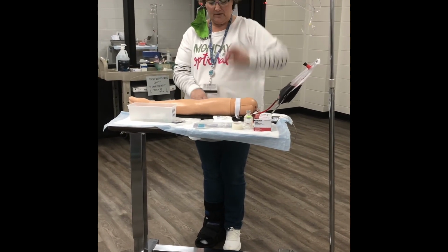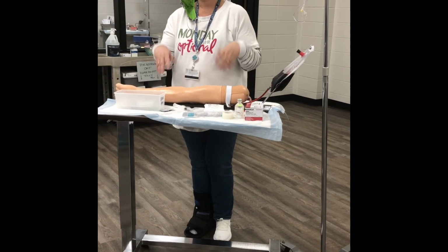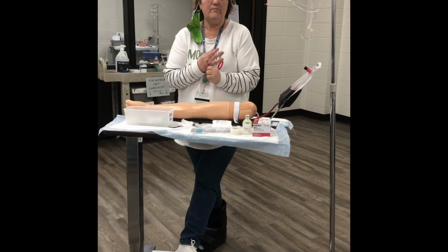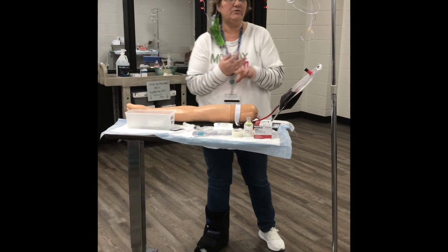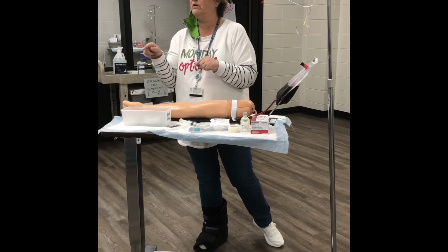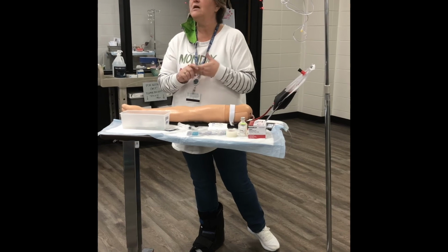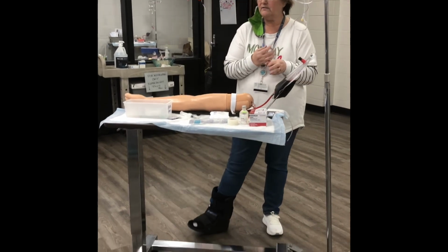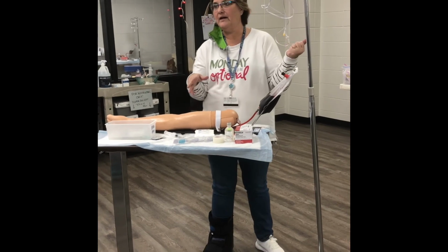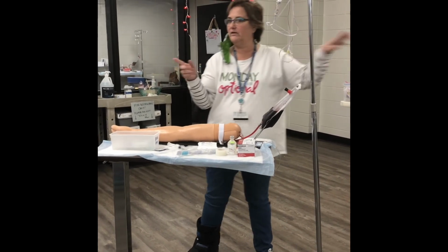We've got our fluid, our INT line is ready to go, and we've got everything else we need. So now, this is magically changed into my patient's room. You will identify your patient like you're giving medication, because that's what you're doing with IV fluids, okay? So name and date of birth, armband, and have them tell you. There are not armbands on these, you just need to verbalize that to them. You will ask them about allergies, and you'll explain to them what you're doing, all right? And so once you've done that, you need to do hand hygiene. You'll just use the alcohol foam, or if it's that stuff right there, use that.